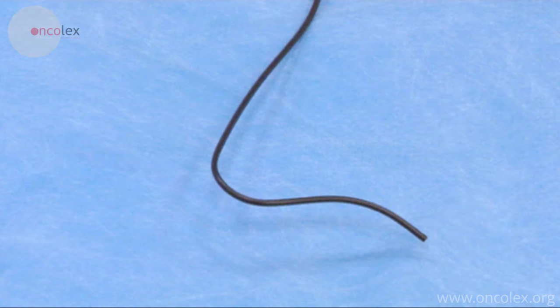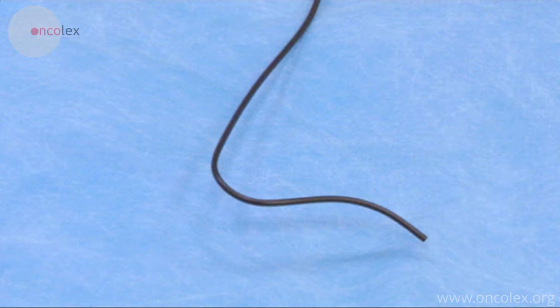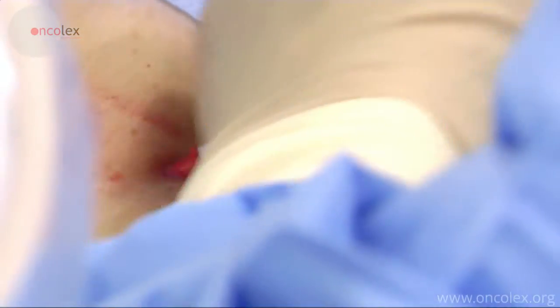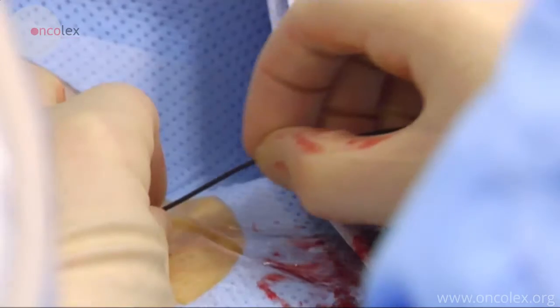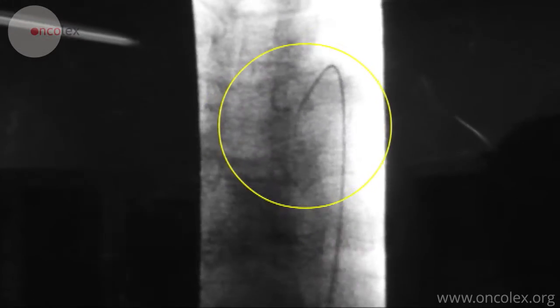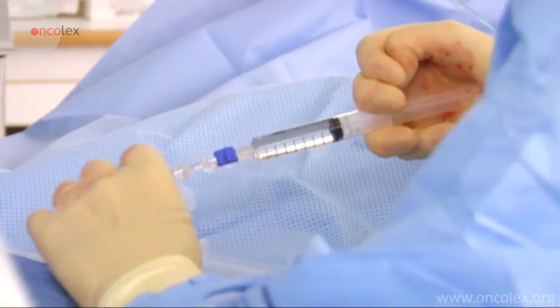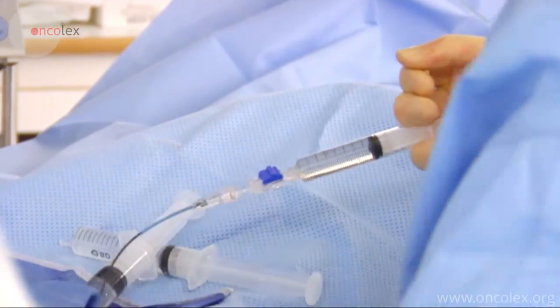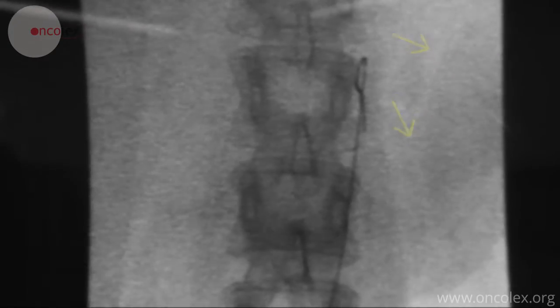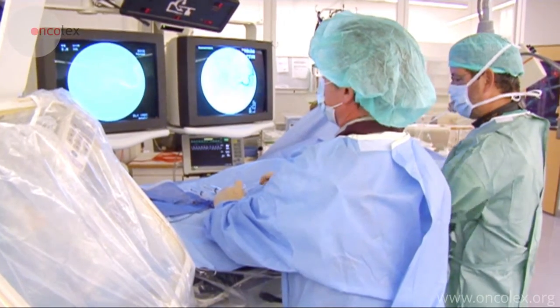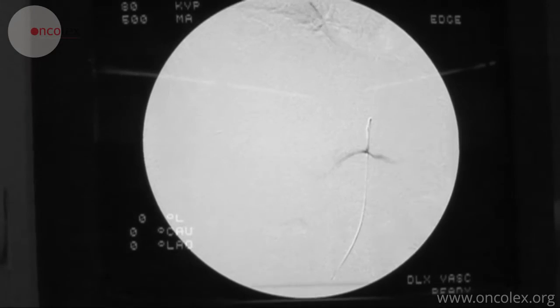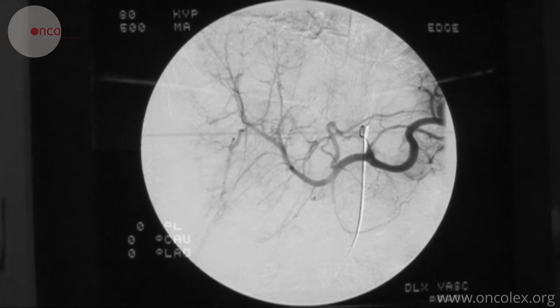A catheter is inserted over the guide wire and moved up to the liver guided by fluoroscopy. The radiologist injects contrast fluid in the catheter to visualize the hepatic artery. A series of angiograms with intra-arterial contrast is taken for more exact visualization and mapping.